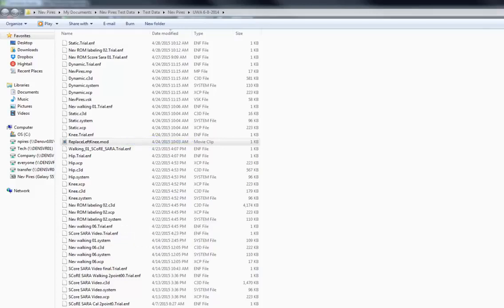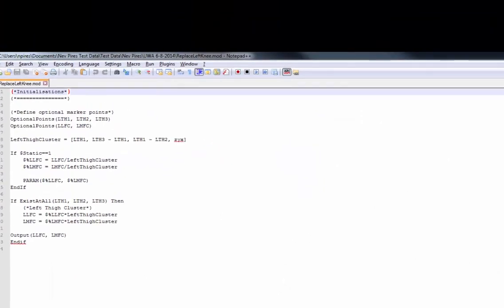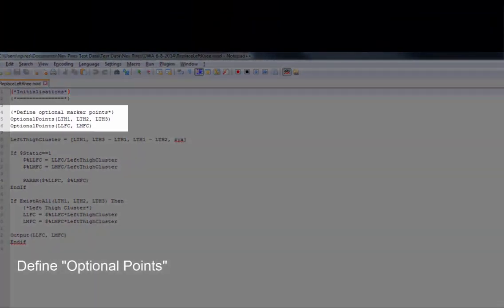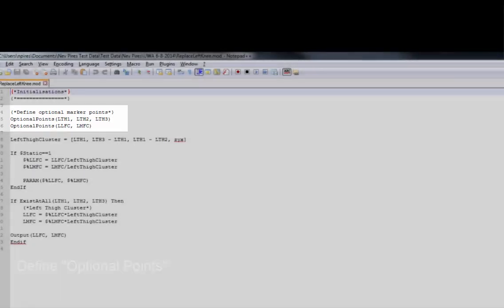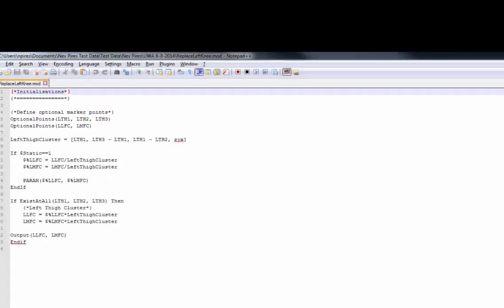I've saved my script in the same folder as my data for convenience. The script I'm going to show you will define the optional points of the left thigh and the left knee markers. These are defined as optional points in case there is a gap in any of those trajectories.